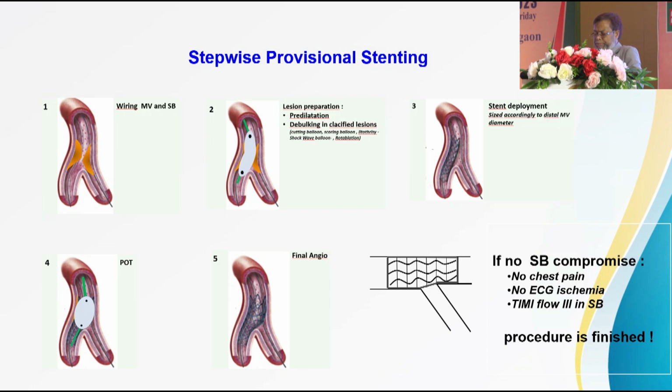If there is no side branch compromise, no chest pain, no ECG ischemia, and TIMI 3 flow in the side branch, the procedure is considered finished.